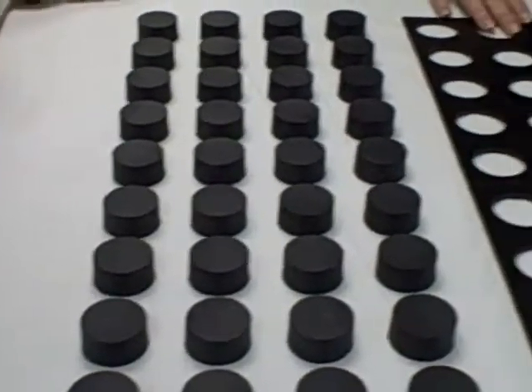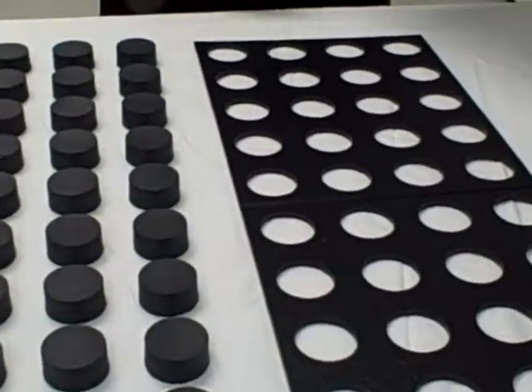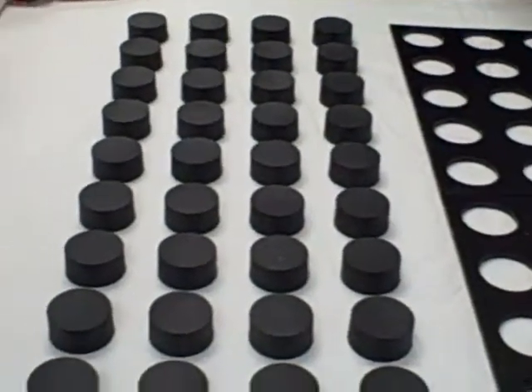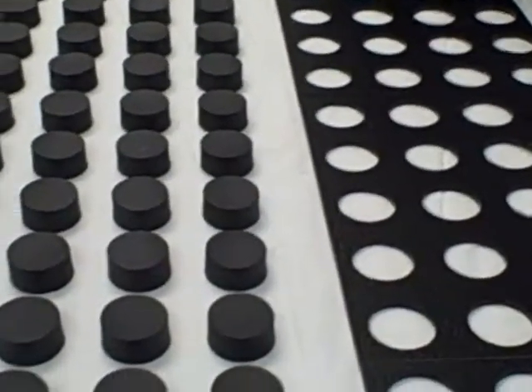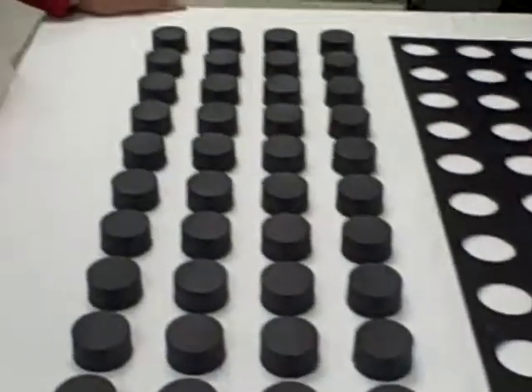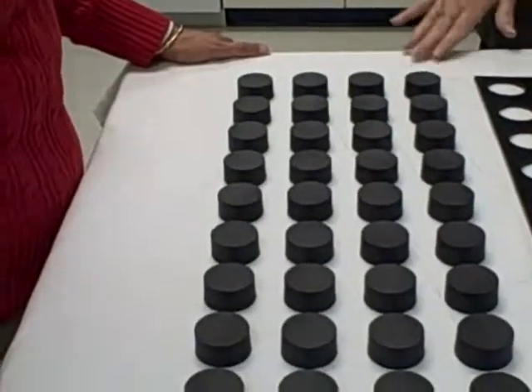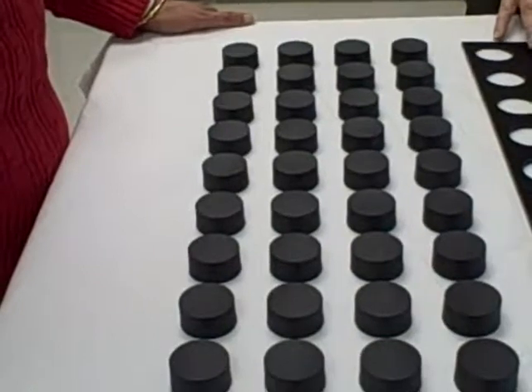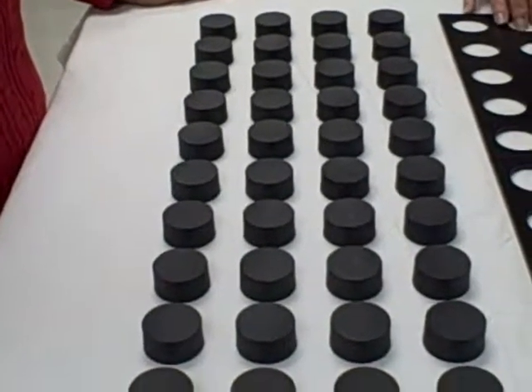You would always, regardless of what it tells you in these directions, it might tell you to always do the dominant hand first, but that's because these tests were made for industrial settings. In a health setting, you will always do the unaffected arm first. And this test was designed to be done standing, so that makes it not appropriate for some clients.